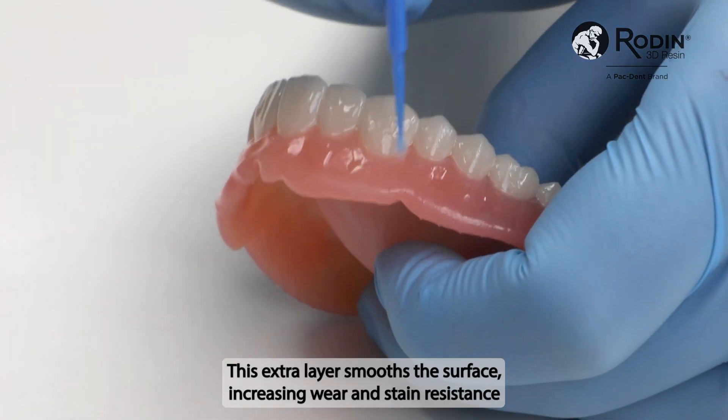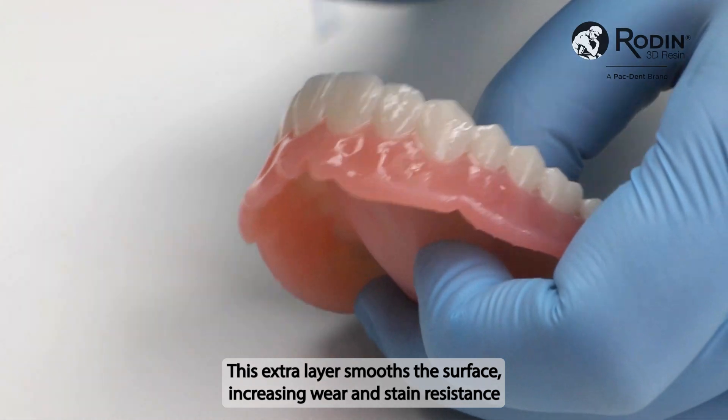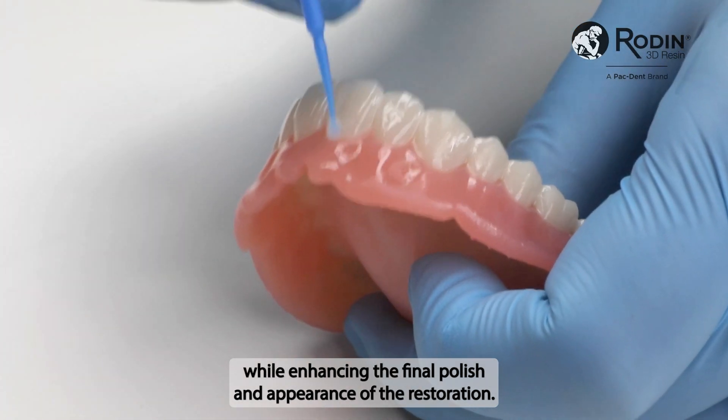This extra layer smooths the surface, increasing wear and stain resistance, while enhancing the final polish and appearance of the restoration.